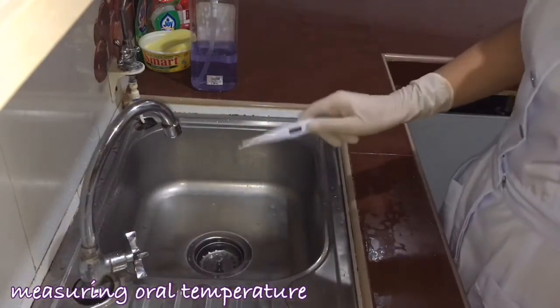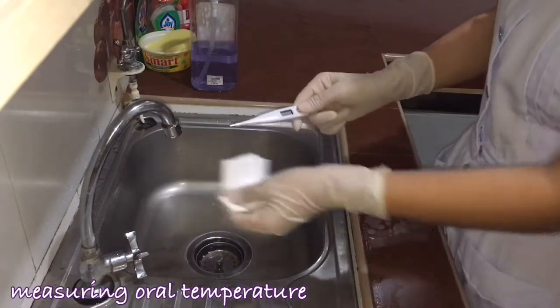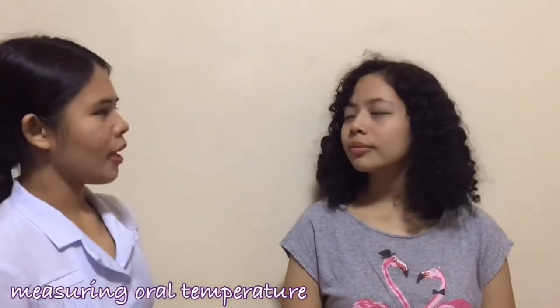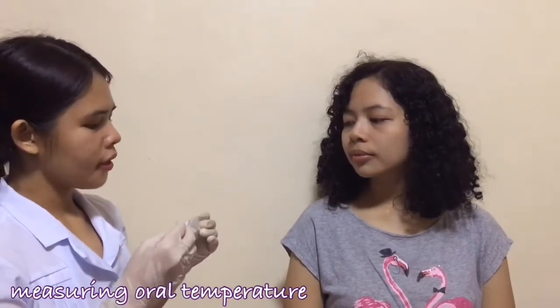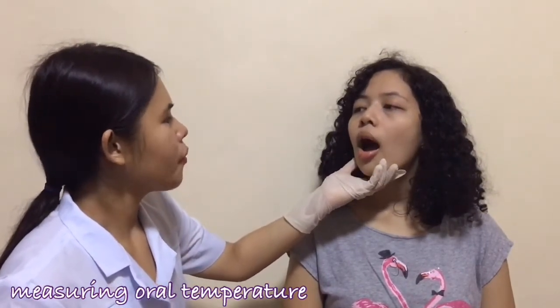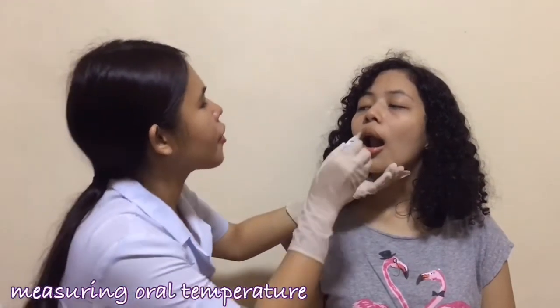Then, lastly, I will tap it dry. Chandra, I am now back and I will measure your temperature. Could you please open your mouth and with the tip of your tongue touch the roof of your mouth. Then I will insert the thermometer under your tongue.